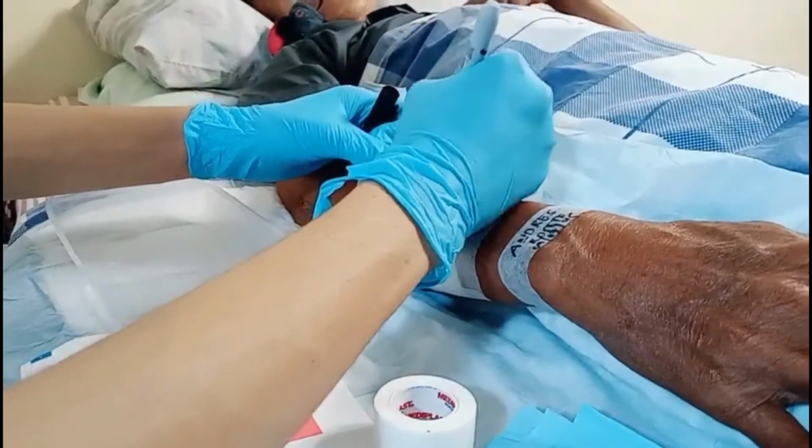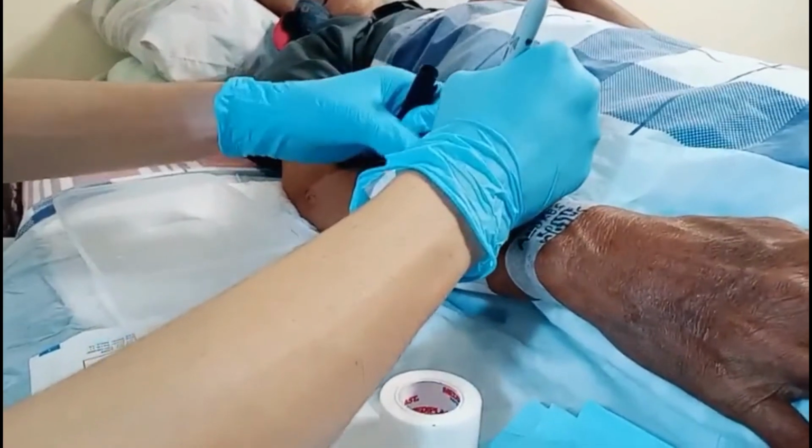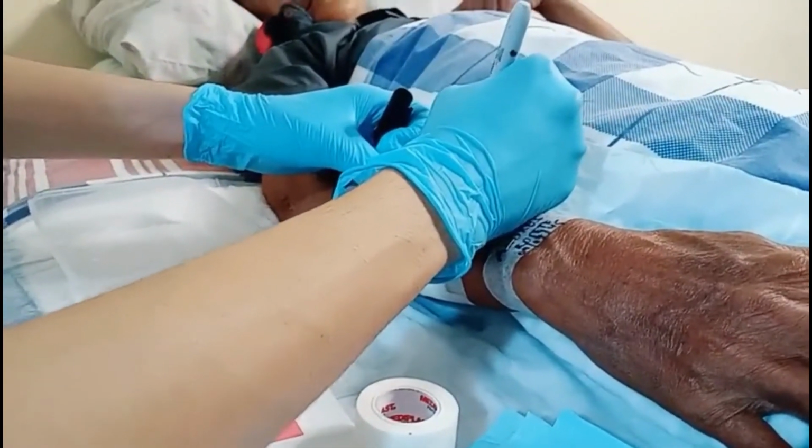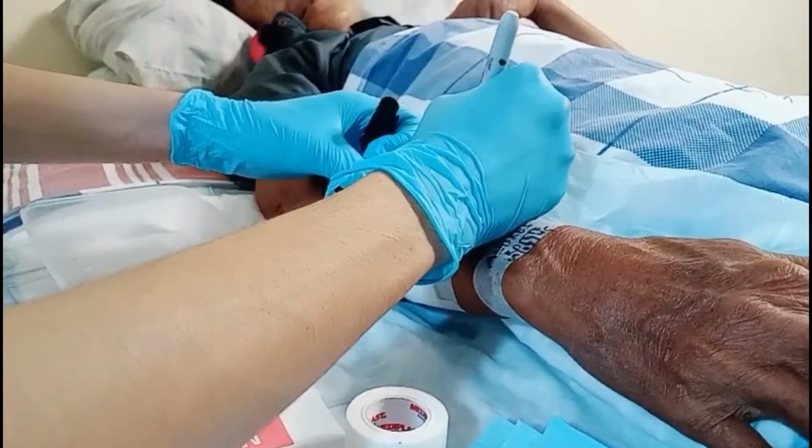Applies appropriate dressing, labels with time, date, and student nurse's initials. This is to provide proper documentation and accountability.